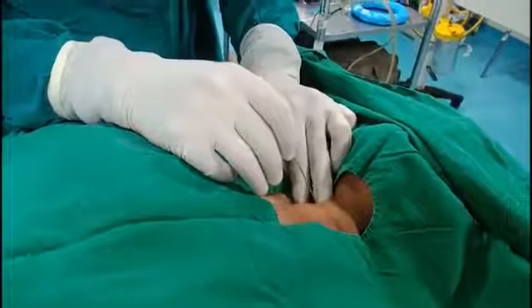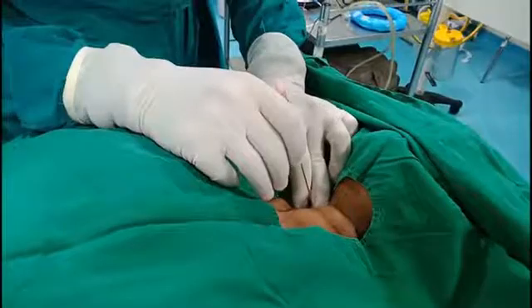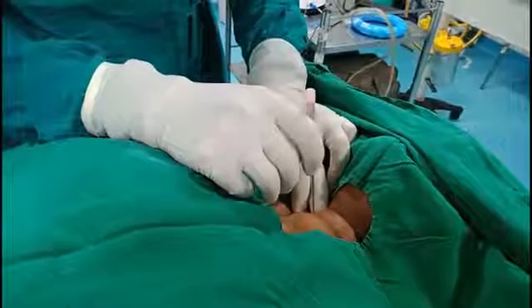Another important point, you should use radioprotective gloves because the procedure is done under continuous fluoroscopy.